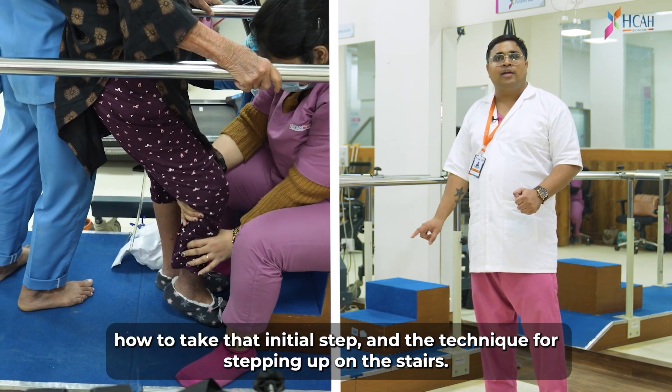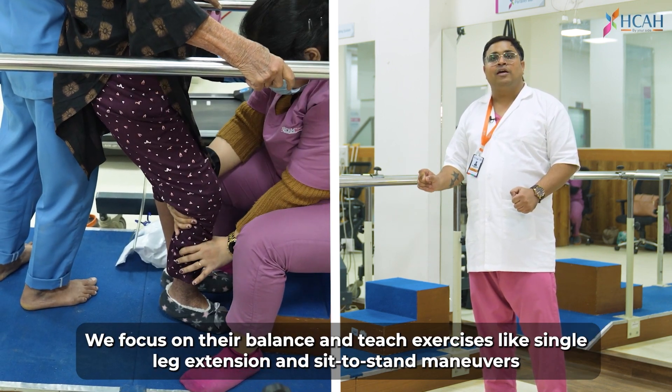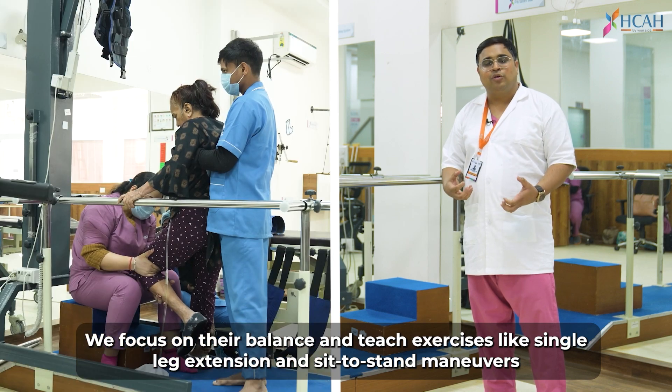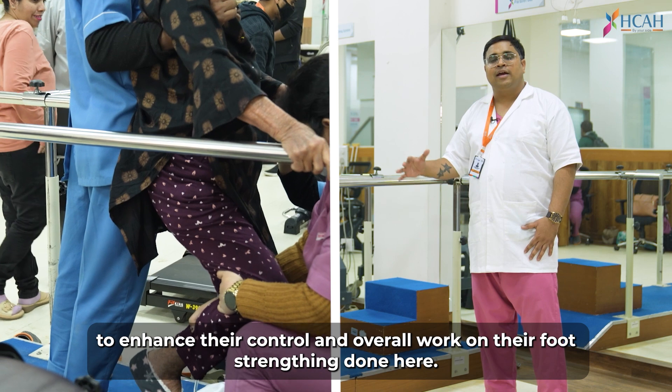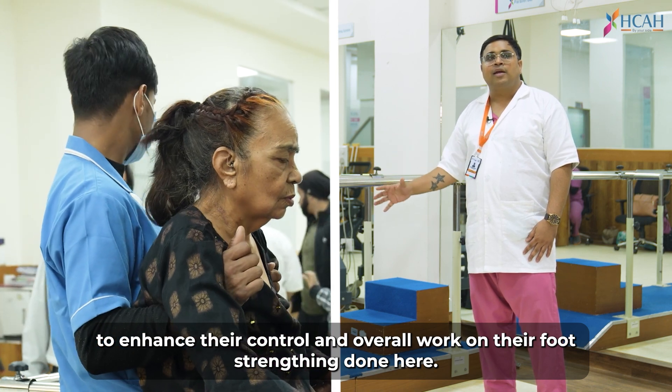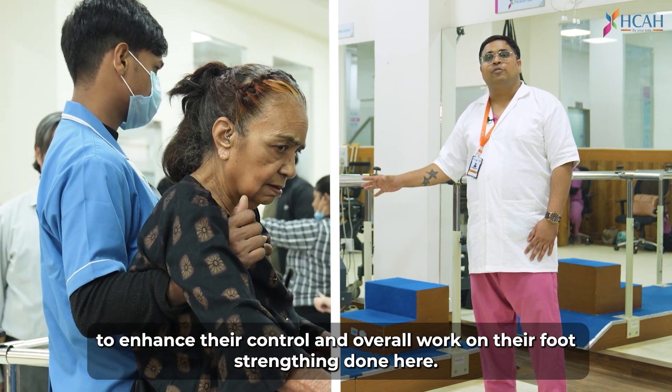How to do staircasing on the steps. He works on the balance — like a single leg standing patient, a sit-to-stand patient. He works on the control of the patient and works on the footwork.